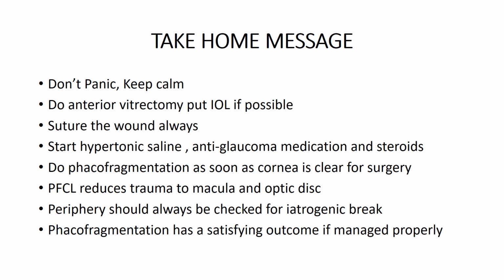So the take-home message is: don't panic, keep calm, suture the wound always, and do phaco-fragmentation as soon as the cornea is clear. Periphery should always be checked for an iatrogenic break.